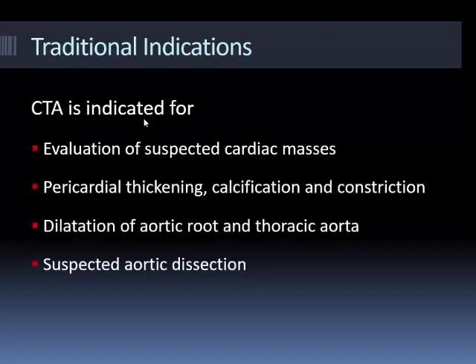Okay, you can also use it, I think I mentioned yesterday, in cases of cardiac masses. Remember, many of the masses that you will see will actually be secondaries rather than primaries, so they're going to need a CT anyway, looking for a potential source of primaries. Remember, common sources are things like breast, things like lungs, but they can be from anything.